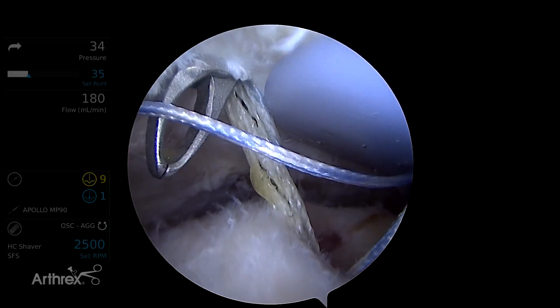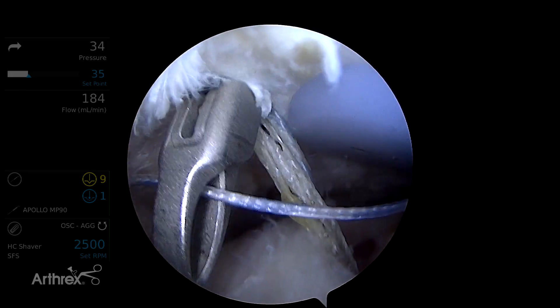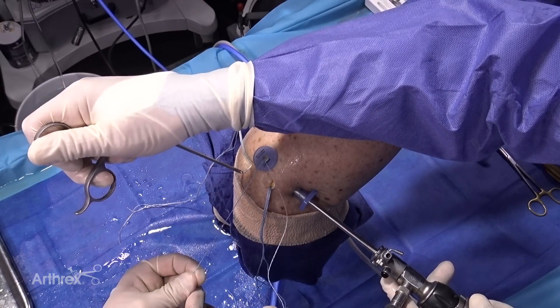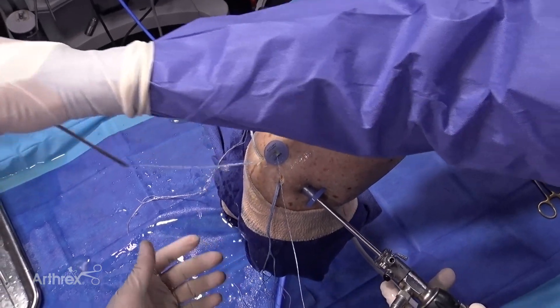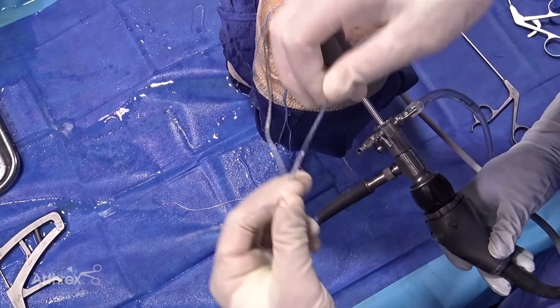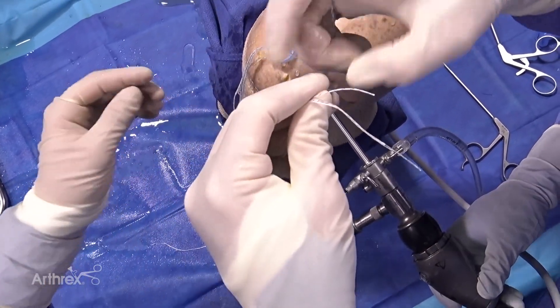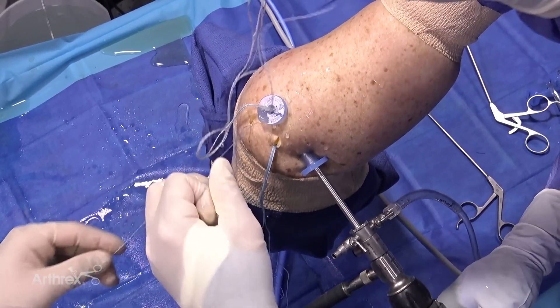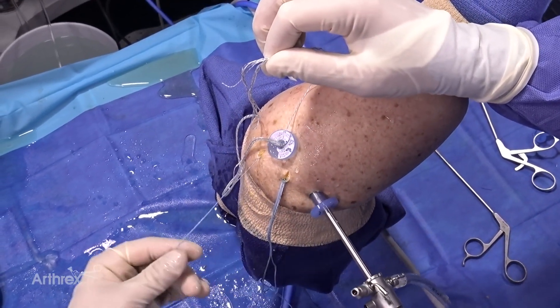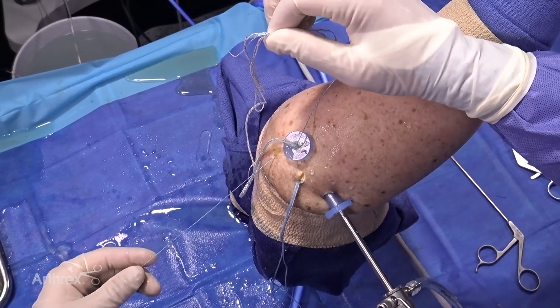The fiber link has a looped end that you'll shuttle through, and then it has a straight end that is the pulling end. So hold on to the looped end and let go of the straight end, and we'll pull the straight end out here. Now what we're going to do is load the fiber link shuttle. We're going to pass all four of these sutures — the two tapes, the working suture, and then the straight end of the passing suture.